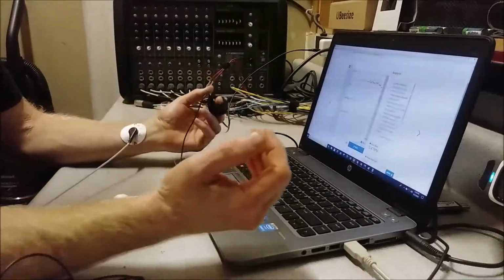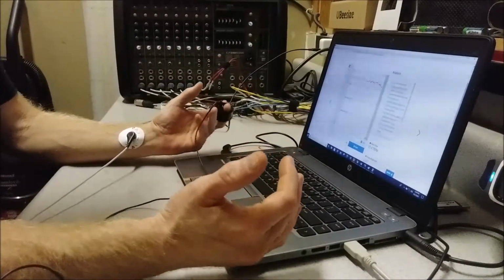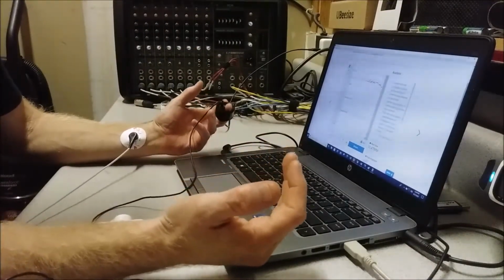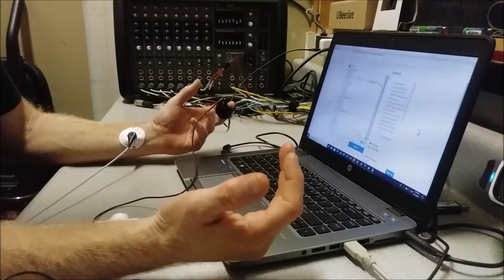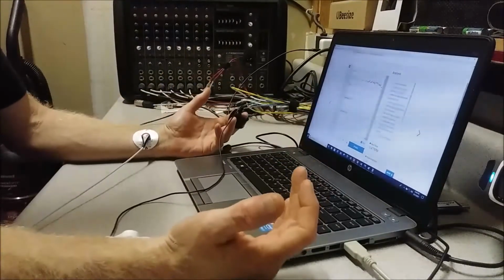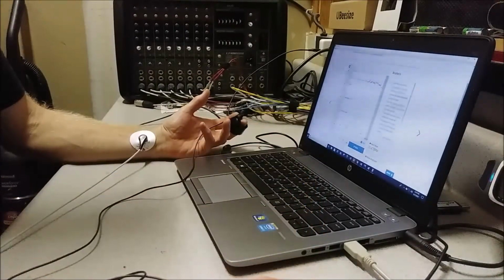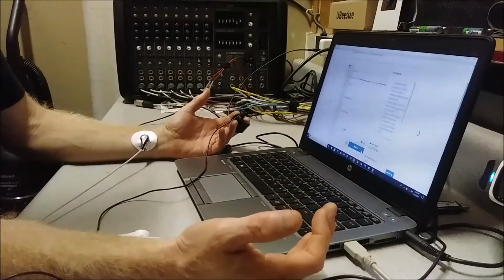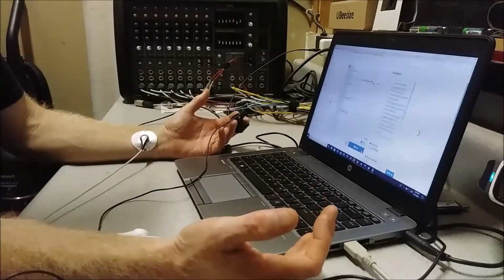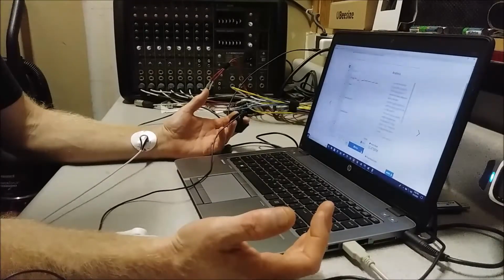Attach electrodes as well as the pulse meter as indicated before. Have the patient sit calmly with their feet on the floor and their arms resting on the table. Then begin the trace. Allow the program to run until 6 to 10 good clean traces have been recorded. Then hit stop.